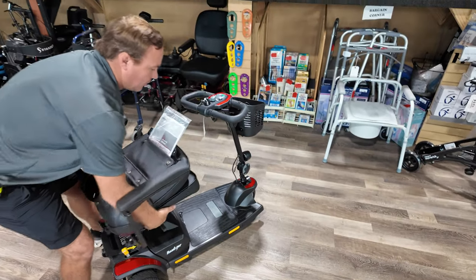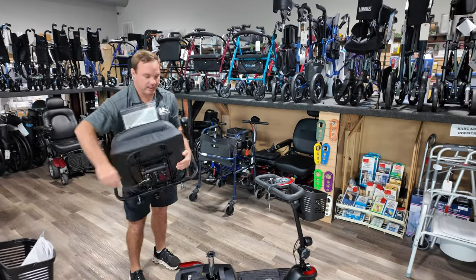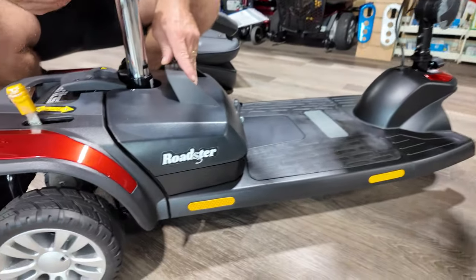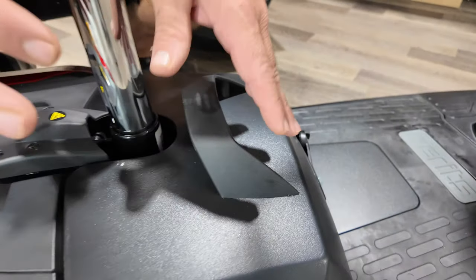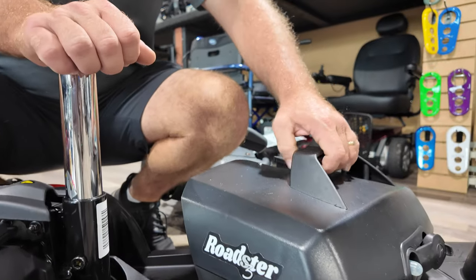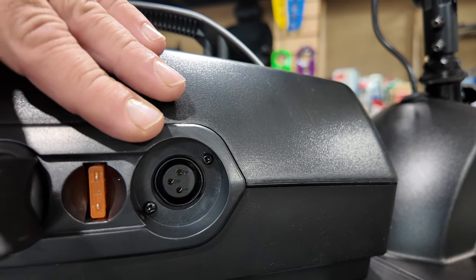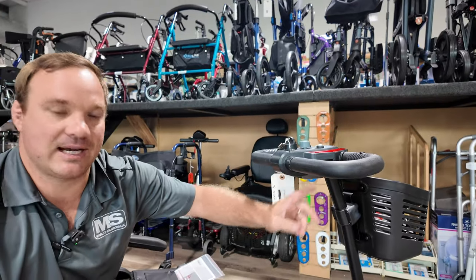To take the seat off, just pull it straight up. If it's a little tight at first, you can put a little grease right here. The battery pack uses two 12-volt batteries. They say about nine miles; I usually say about two to three hours, so if you're not riding it for long periods you'll be fine with this small battery pack. You charge it through this port and you can take the battery inside your house to charge it. Note that on this unit you don't have a charging port on the dash.